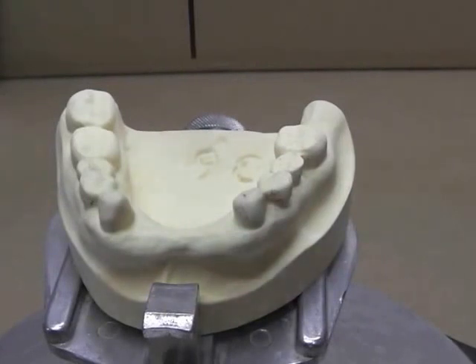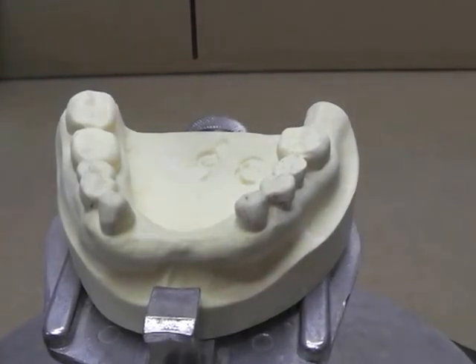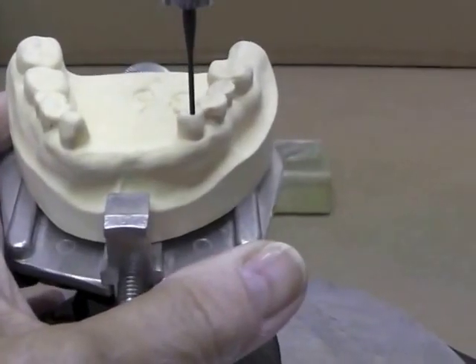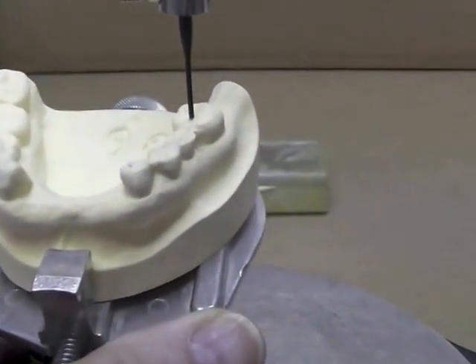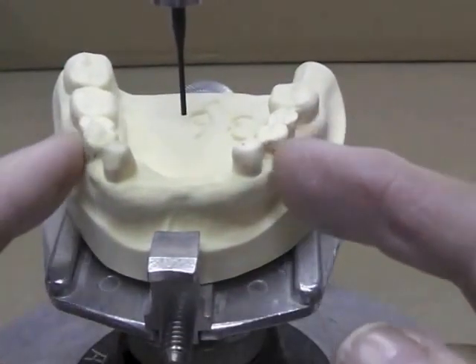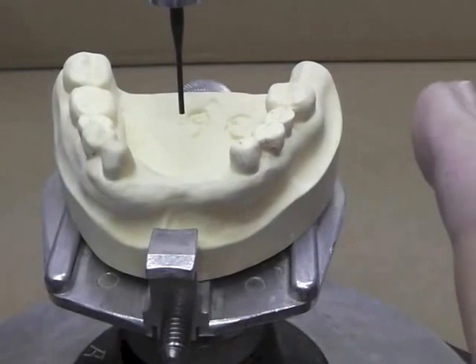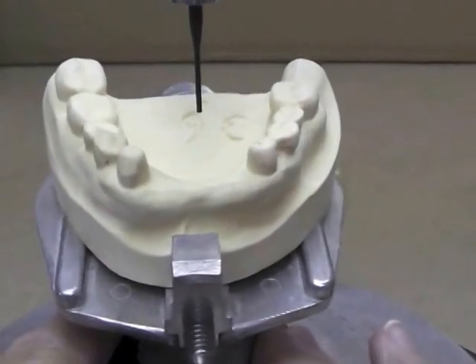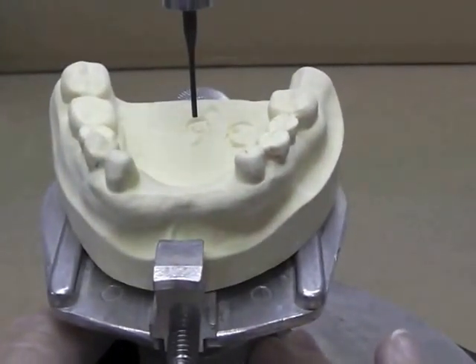Armed with a wish list, I'm going to survey my cast. What I'm trying to do is find a path of draw for my removable partial denture that fits the design I would like, with the least amount of tooth adjustment as possible. We start with our cast lined up so the occlusal plane is relatively parallel to the floor, and I'd like to look down the sides to see if I have about the same amount of tilt — what the undercuts are looking like when I look down the crest of curvature on each side.